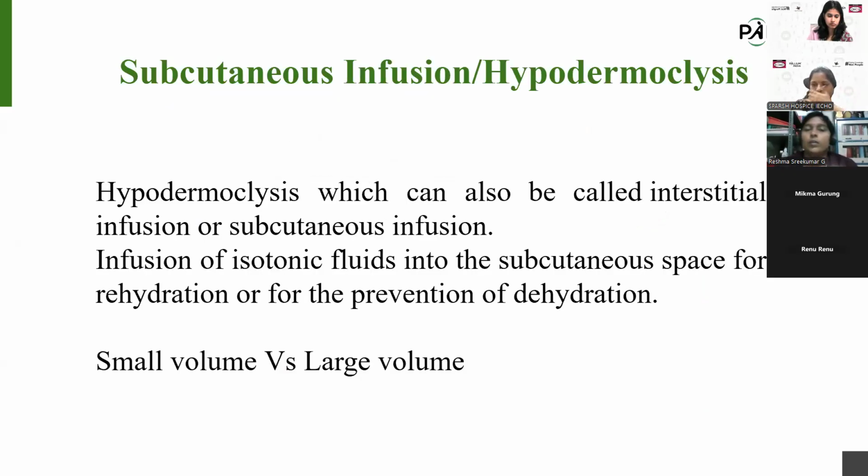Subcutaneous infusion is otherwise called hypodermoclysis. The word itself means what it is, because hypodermo means beneath the dermis and clysis means slow infusion. Hypodermoclysis can also be called interstitial infusion or subcutaneous infusion. And here we are infusing isotonic fluids into the subcutaneous space.